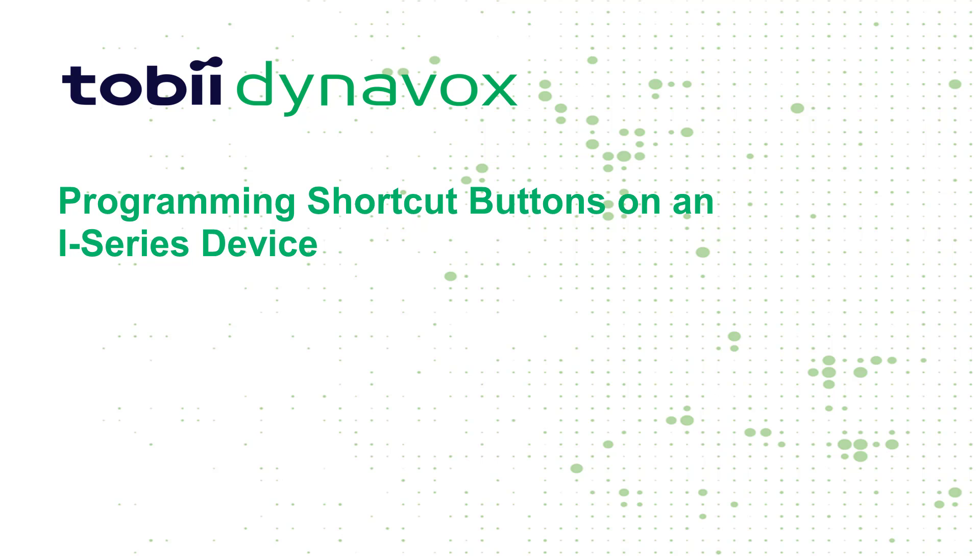Hi everyone! Today I'm going to show you how to program the shortcut buttons on the left side of your iSeries device.